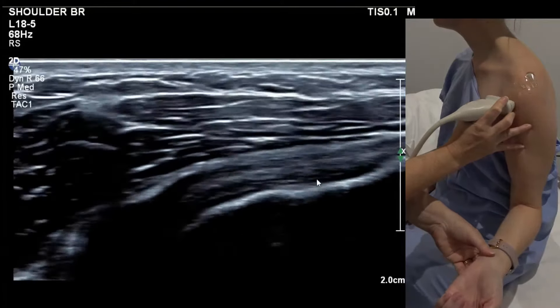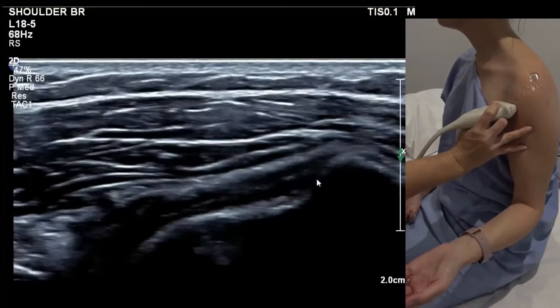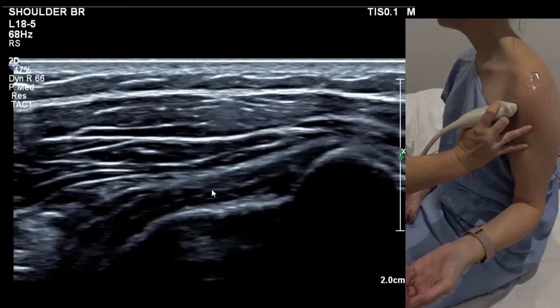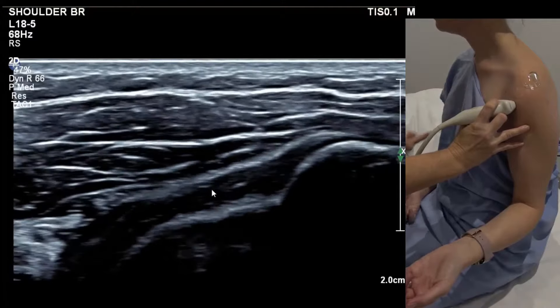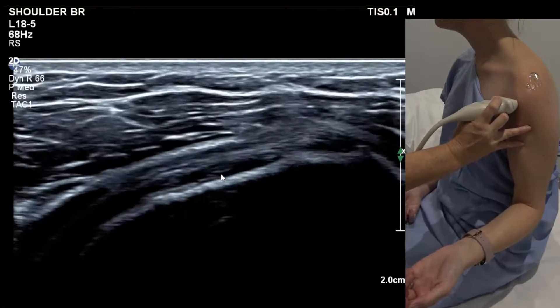You don't want to go so far that it's pointing to 3 or 4 o'clock — the fibres go anisotropic there. The best way to start imaging is to go too low so that you're on a muscular-looking subscap. Start at the very bottom; it's more like an oblique so the medial end points down.